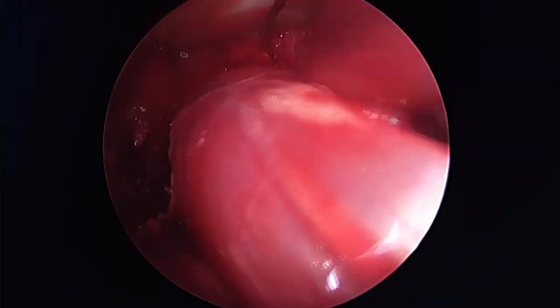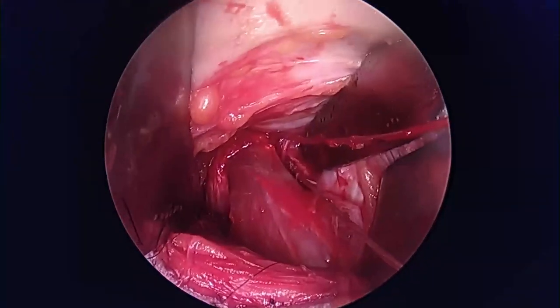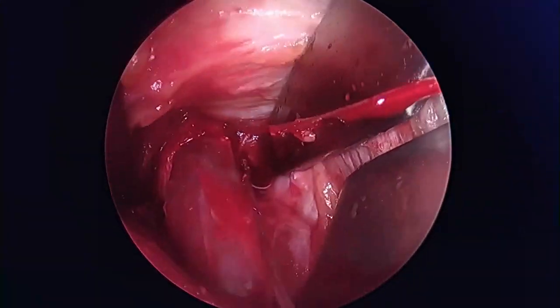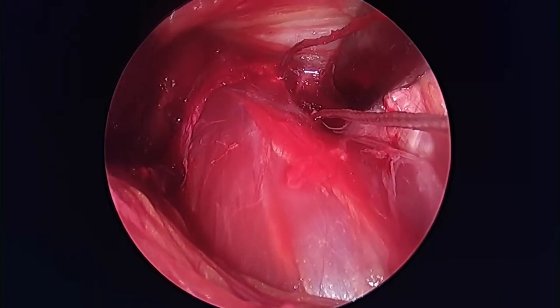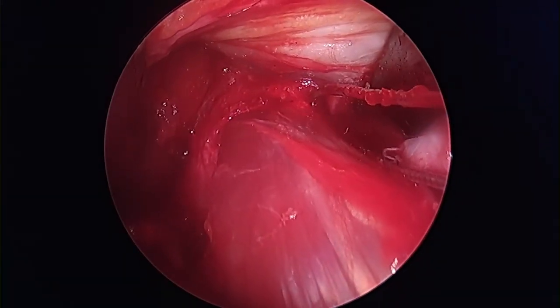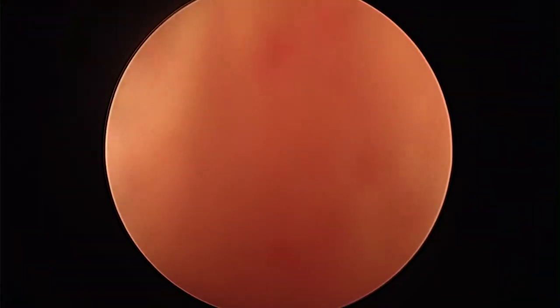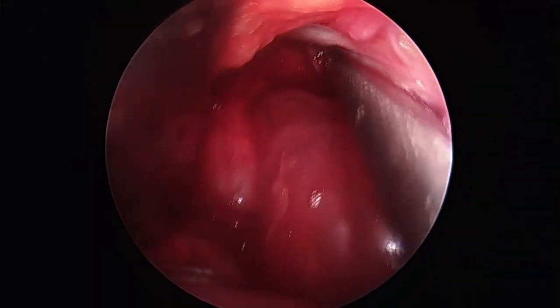So that's what we have. Now what we can see is that the muscle tendon junction is underneath the pec because we have one retractor on the pec. These are the sutures coming out. Once we let go of this tissue, it will cover the muscular portion of the biceps and there'll be no gap. And therefore the patient will recognize it as being normal for them. So we basically just have to cut our two sutures and then this comes down. We just let the pec relax. We can see how that'll sit right underneath the pec tendon in a nice clean spot. There's our pec tendon, we lift it up, we put it down, it's going to rest right over the top of our muscle tendon junction, and that'll be what the patient will see, and it looks normal for them.